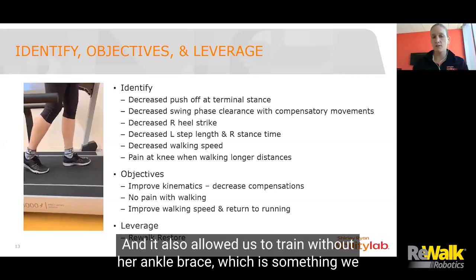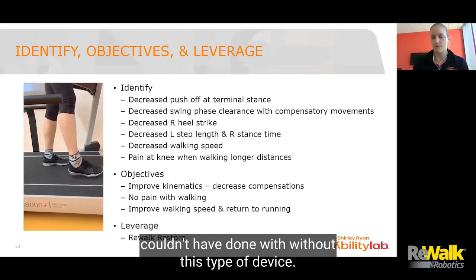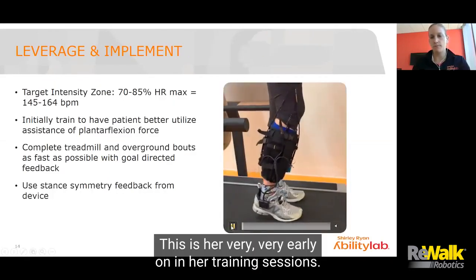It also allowed us to train without her ankle brace, which is something we couldn't have done without this type of device. This is her very, very early on in her training sessions.